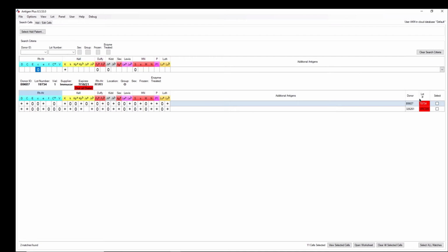Okay. Yeah, I understand. Yeah, it's just a little bit. When I used to do demos, I would go through all of this, and everybody's heads were spinning, and they didn't want to hear it if they didn't know the program. So I kind of wanted to give you a feel, because this is sort of a different thing than a sales promotion.